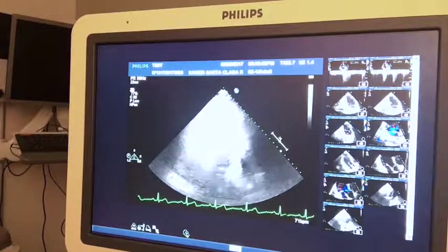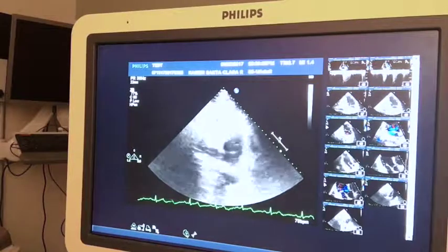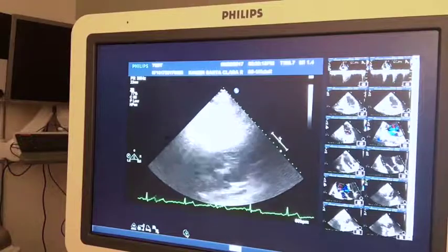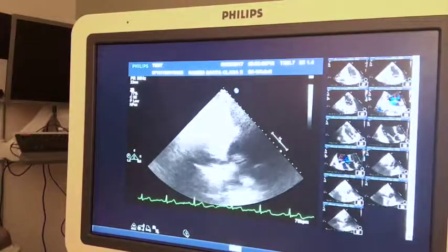Slowly breathe in again, big breath in, big, big, big, full, full, full. Hold that breath right there, don't move. See where you went. So there's the vena cava again, right? Breathe normal. Now you should do a sniff, which is, yeah, you have him snort, and he did this.